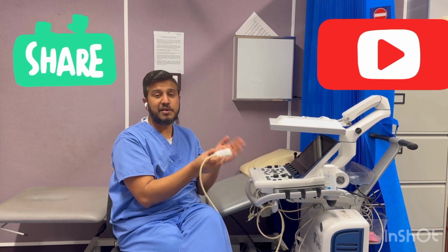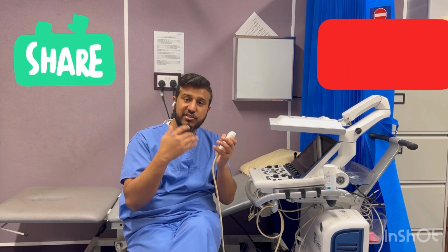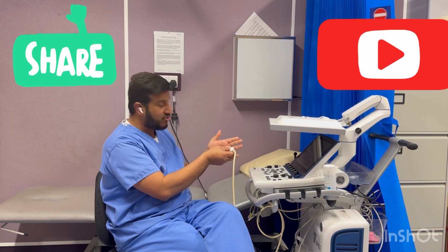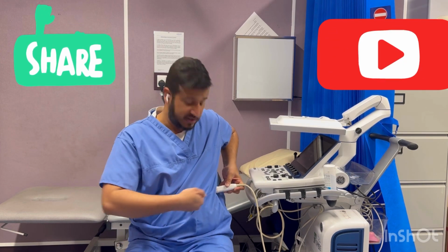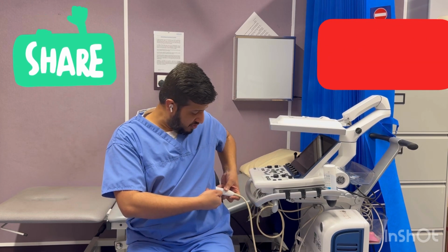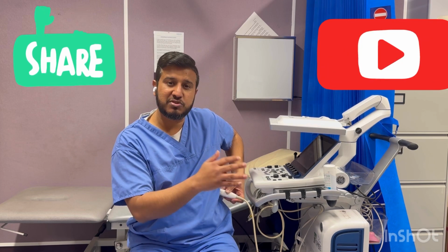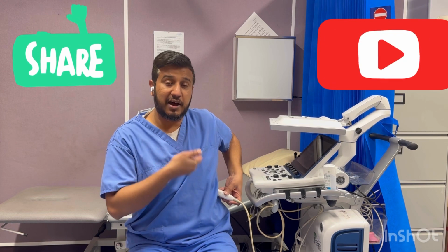Now there is a very important thing once you are doing the apical views. Apical views are easy to understand but slightly difficult to acquire. Why? Because most of the people keep the probe this way and try to get the imaging, which means you are sending the waves to this side. What you need to do is keep a bit angulated probe. Your angle from your patient's skin towards your probe should be around 45 to 60 degrees, like this. So you are sending the waves towards the heart.